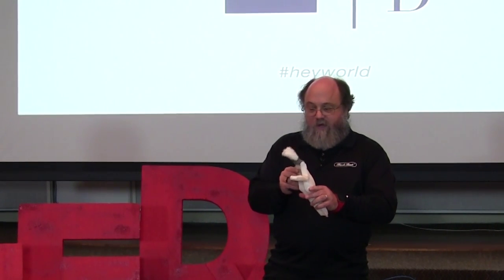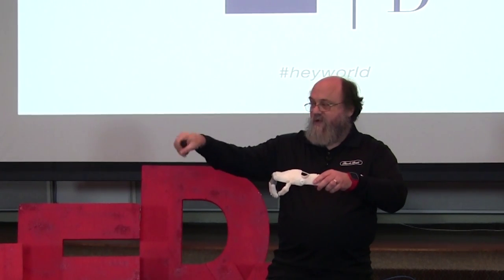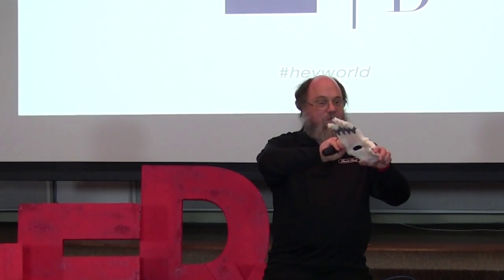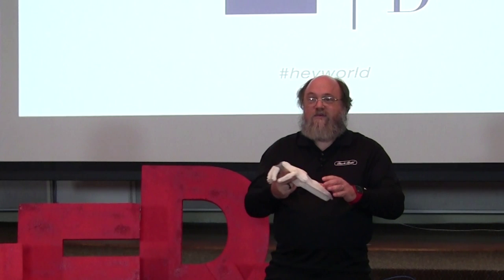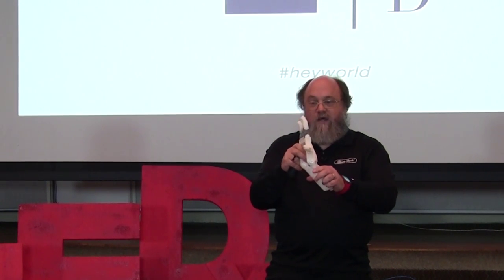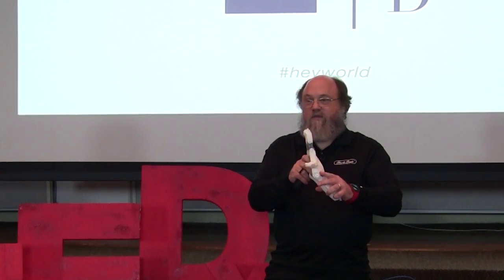This is a hand design called the Osprey. The way the hands tend to work, this is a mechanical design. It's just by somebody bending their wrist, and it makes the grip open and close. So if you guys can see how that works. It's a simple push-pull mechanism that was actually invented by an artillery engineer, I think in the 1800s, who blew one of his hands apart. And being an engineer, he came up with a solution. Of course, that involved metal and wood and carving and welding and things like that. And now 3D printers make that a lot easier. But essentially, it's a very simple mechanical design, so no patents, yay. And so it's very easy to produce and quite effective. So actually, let me pass that around so everybody can get a feel of it. It'd be pretty hard to break, so don't worry about it.